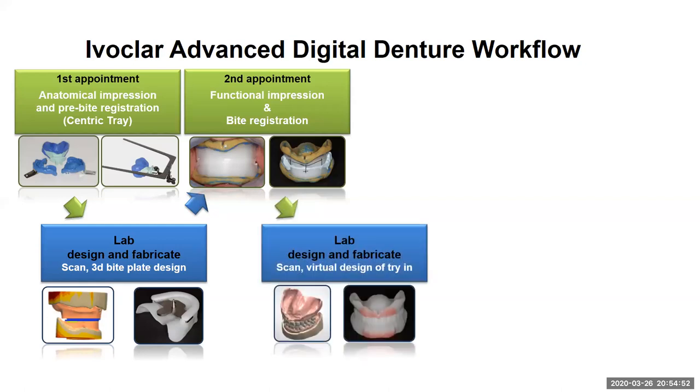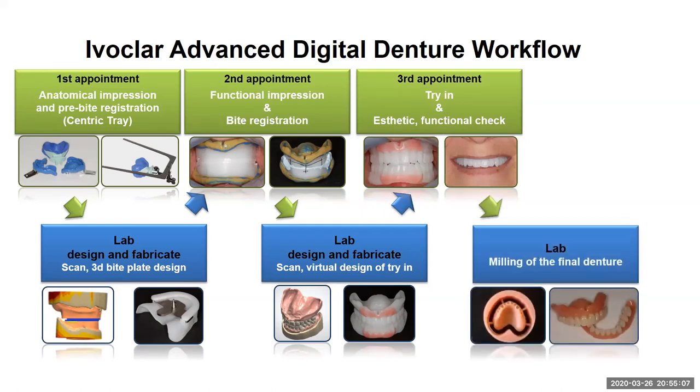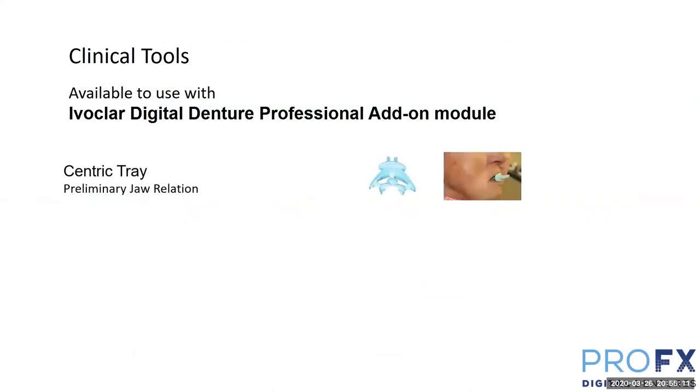It takes a little getting used to, a little bit of a learning curve, but all that information is taken from us, and you write it down on an RX, and we enter this into the software. And again, the next visit is the same as usual. I'm going to print a try-in, I'm going to mill the denture for you, and you're going to insert it on the fourth appointment. So, these are the clinical tools.